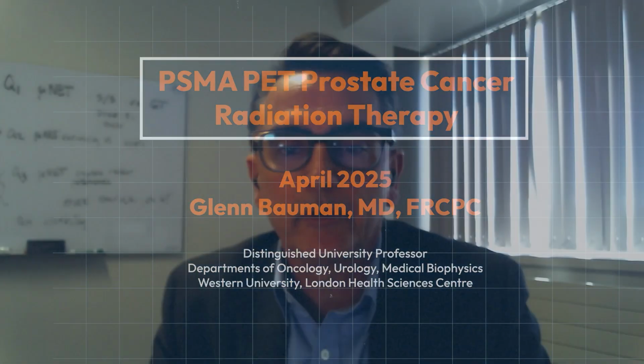Hi, I'm Glenn Bauman. I'm a professor in the Department of Oncology at Western University in London, Ontario, radiation oncologist, and I'm happy to present some practical examples of integration of PSMA PET CT into radiotherapy.